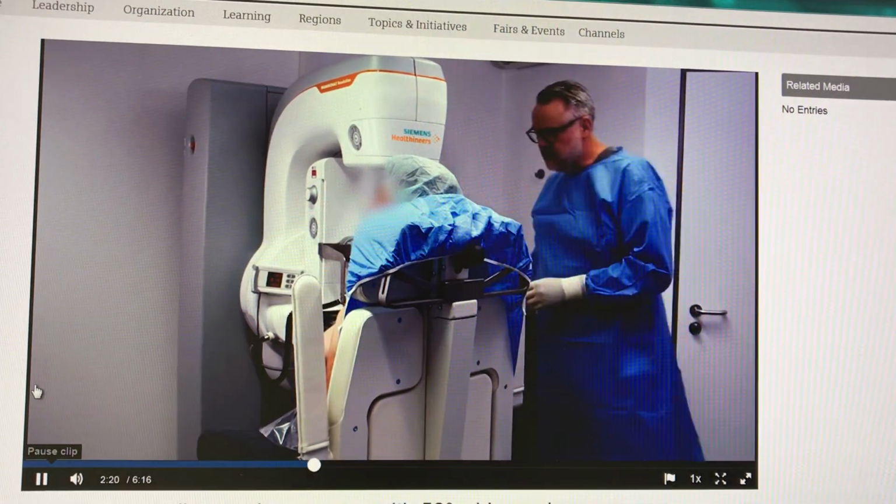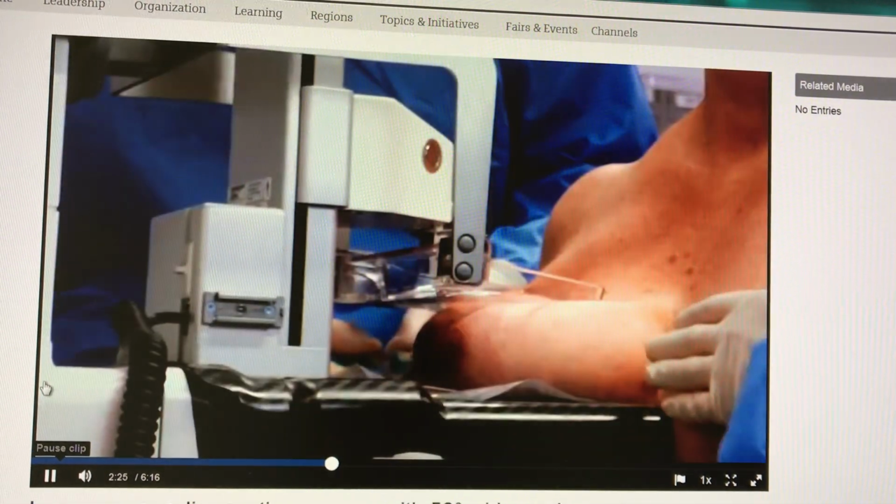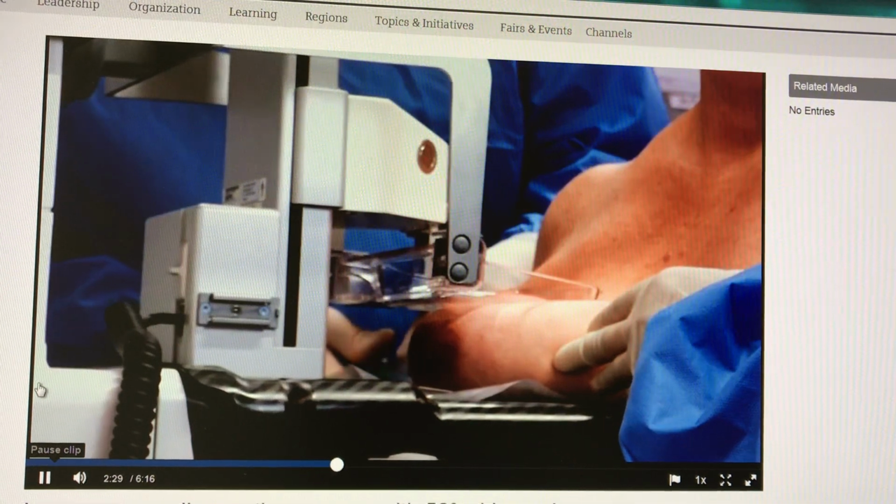We put a great deal of emphasis on carefully applying local anesthesia and have the flexibility to apply more local anesthetic even during the procedure if needed.